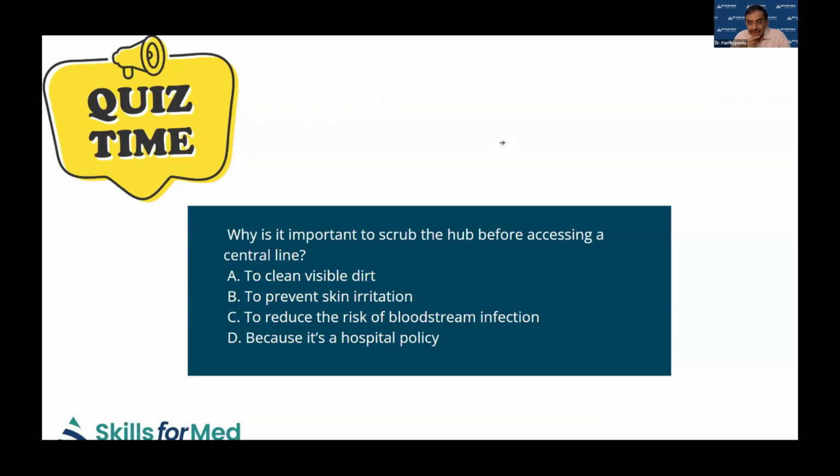You're asking me or the participants? I'm asking the participants. You know the answer, right? Yes. So why? Because I'm always in a hurry. I just want to do 5 seconds. Why are you telling me to do 15 seconds or 30 strokes? I think to reduce the risk of bloodstream infection, because the action will happen in the 15 seconds. Action? Making it dry?